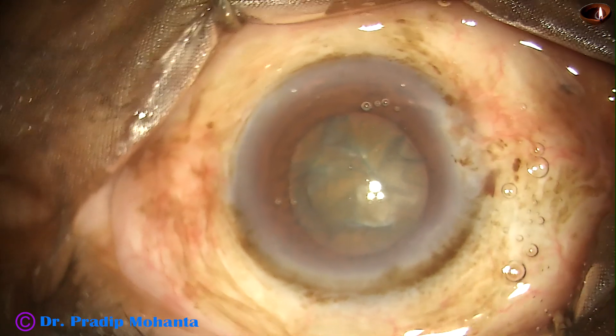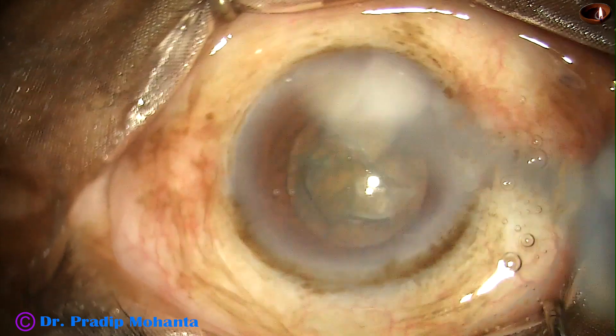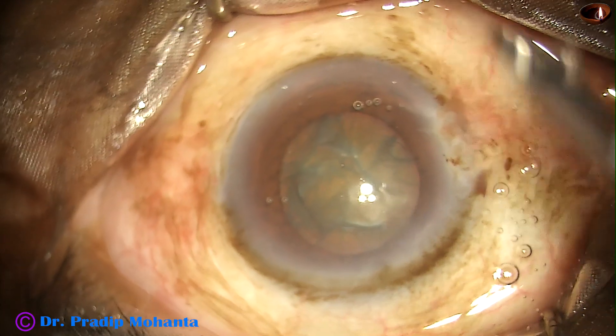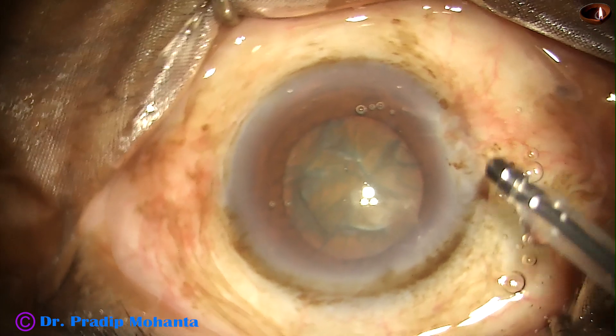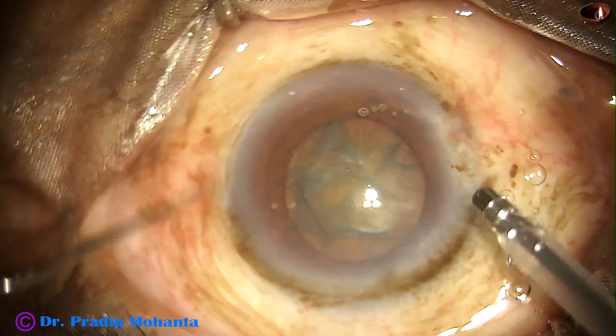The pupil has dilated up to 6 mm. By this time, all the incisions have been made. Capsulorhexis has been done. Hydrodissection has been completed.